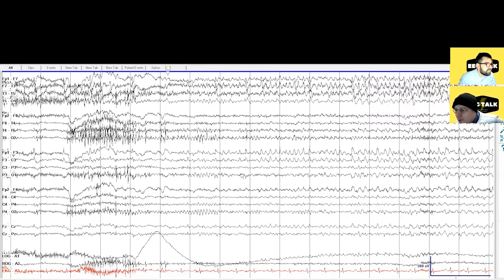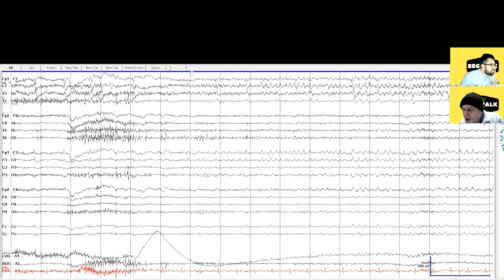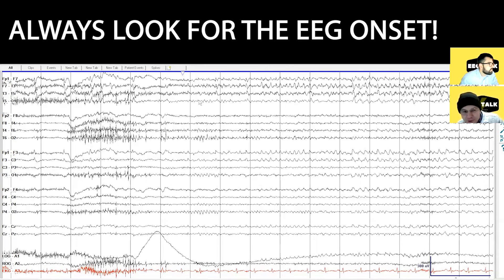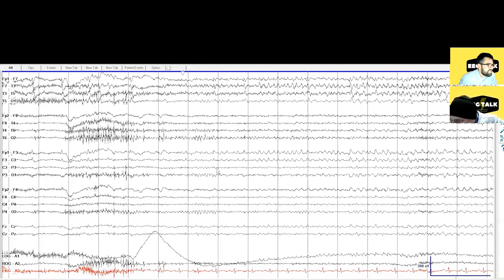Where does it start? Let's find the time and location where it starts if we can. I think it starts around here. Yeah, I think that's a good place. We often talk about the first unequivocal electrographic change. Are you thinking what I'm thinking? I think I am thinking what you're thinking. So I think that's a good place for the first electrographic change.